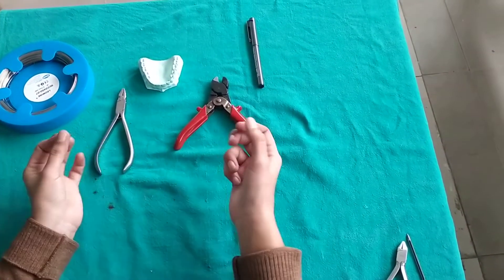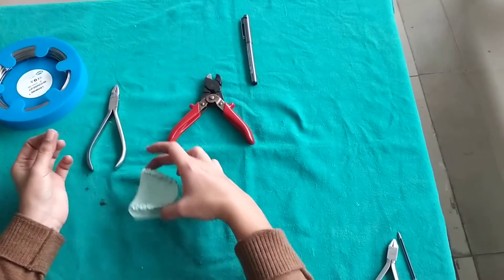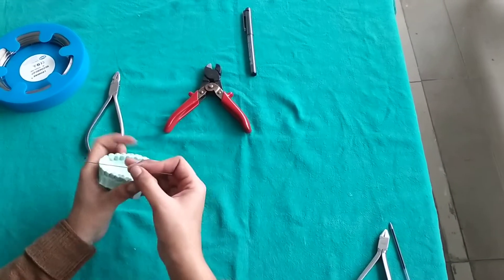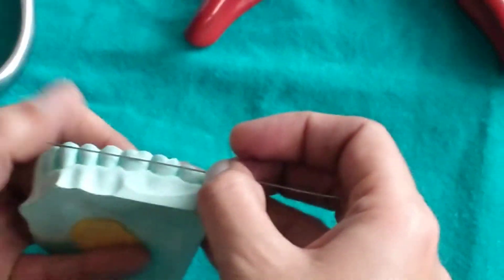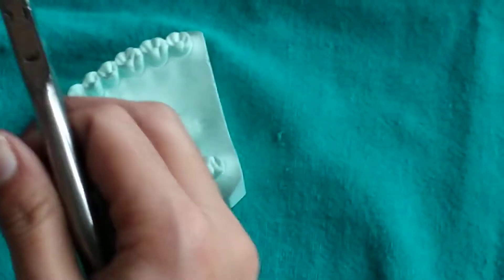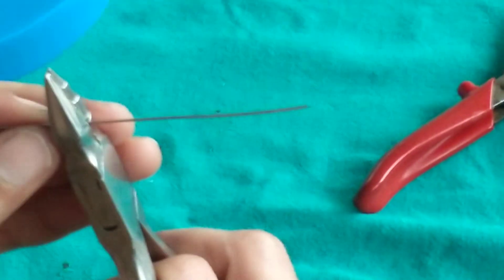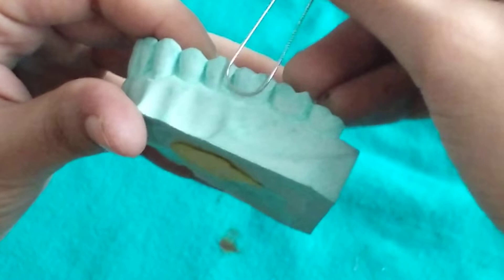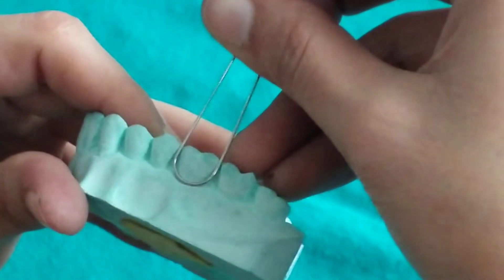We have a small segment of wire. The U-clasp, which is also called a full clasp, has a U shape, and the width of the U is equal to the mesiodistal diameter of the tooth. So first we will bend a U equal to the mesiodistal width of the tooth.